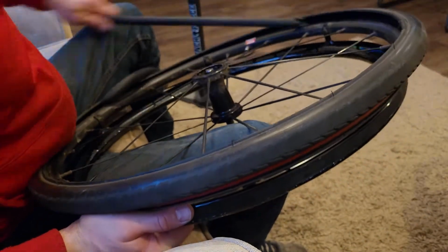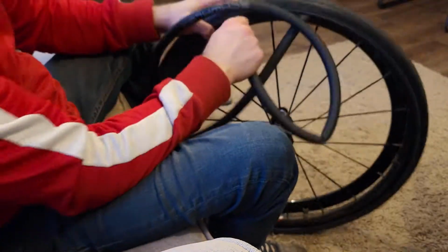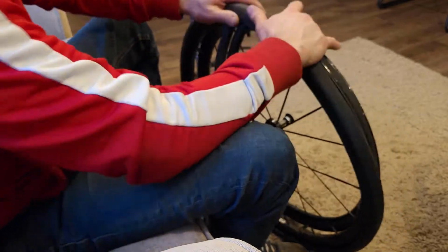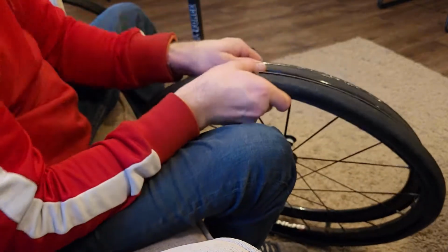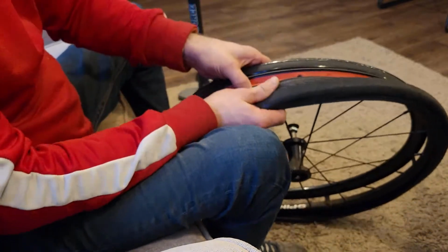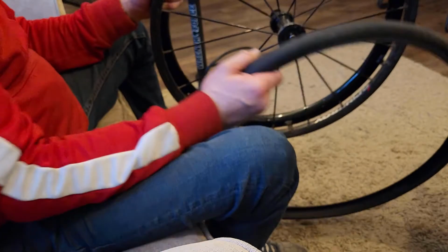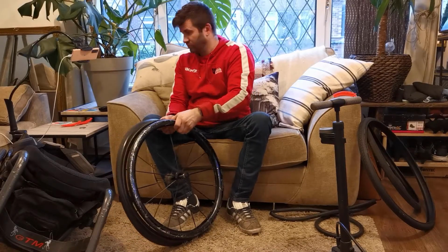Now if I was just repairing this inner tube, if I'd had a puncture, I would be able to just repair that tube from how it is there, put the new patch on, let it dry and then slip it back in. But as it is, I want to replace the tube as well. It does have a slow puncture on that tube, and it's just going to be better to replace it on this occasion. So I'm going to take the tyre off, and I'll show you now just how bald that tyre is.